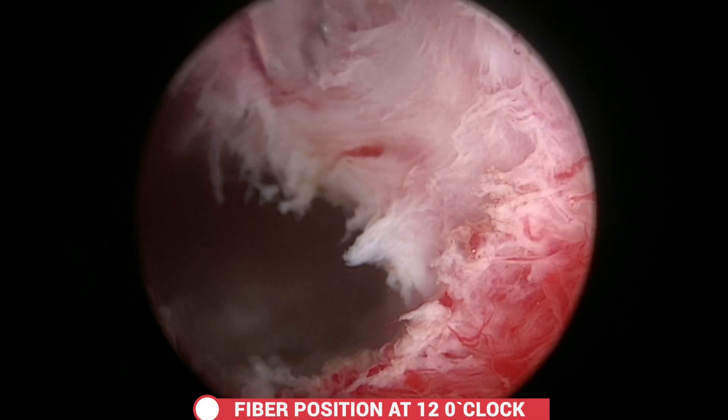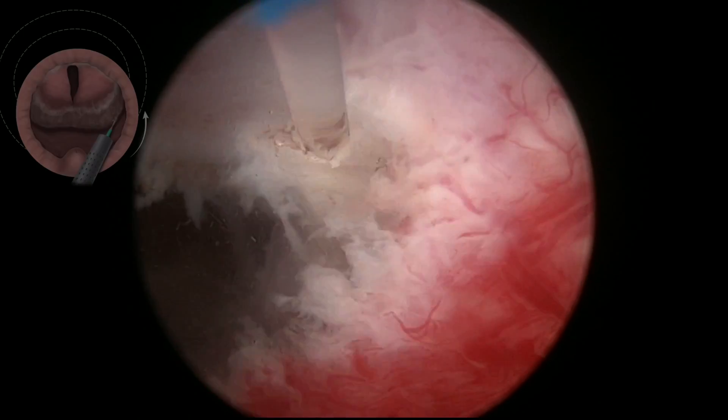Once the posterior plane is developed, the fibre is rotated and taken towards 12 o'clock to start the early apical release.